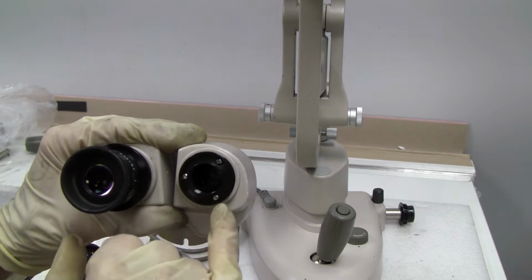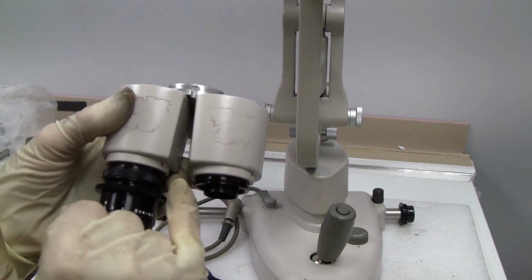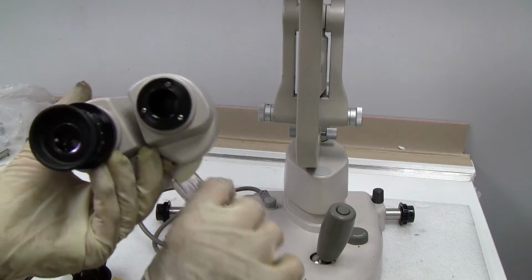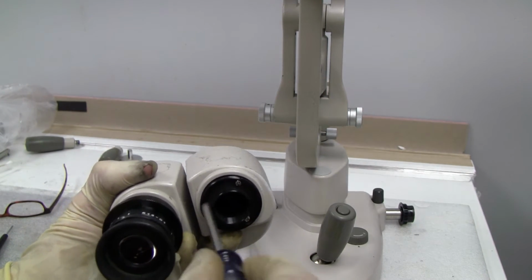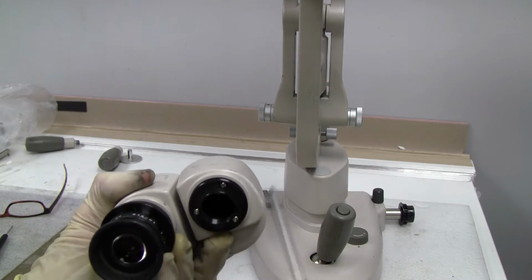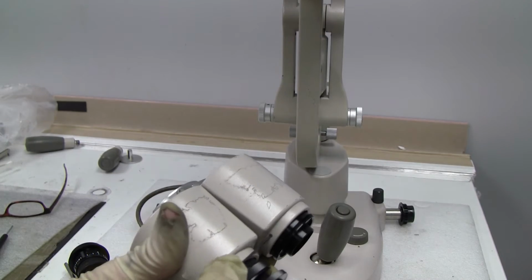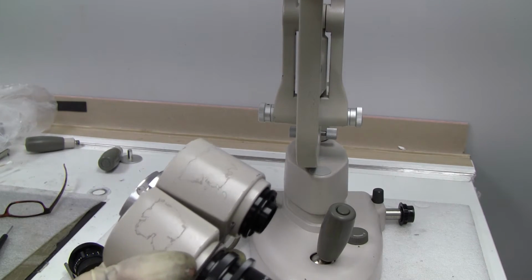and in here you have 3 screws, 3 Phillips, but then on the outer edges you have 3 set screws, 3 Allen set screws. So what you'd have to do first is loosen these Phillips just a little bit. And then take your Allen wrench. I believe it's a 1.3 millimeter. And you would have to loosen all 3 of your Allens just a little bit.